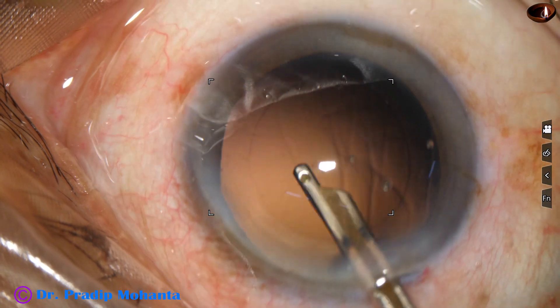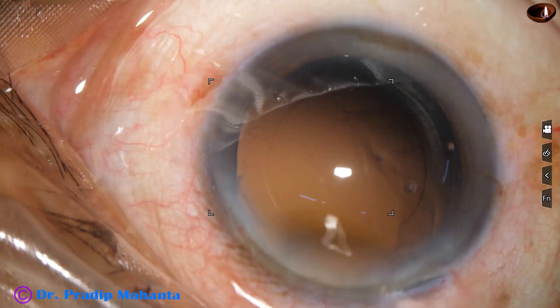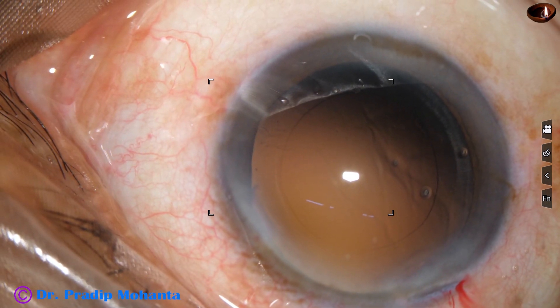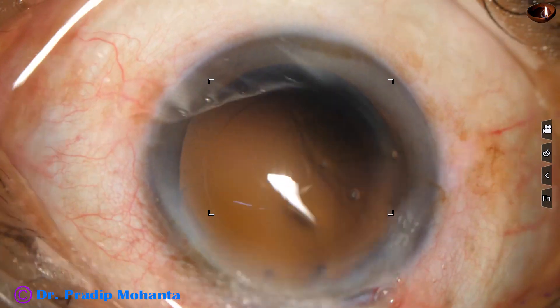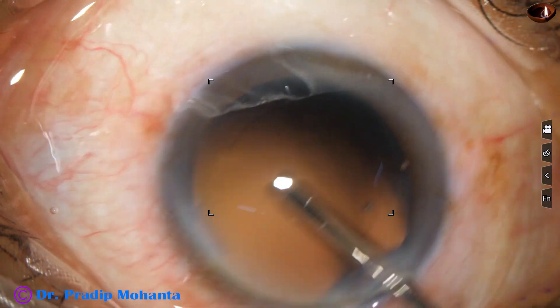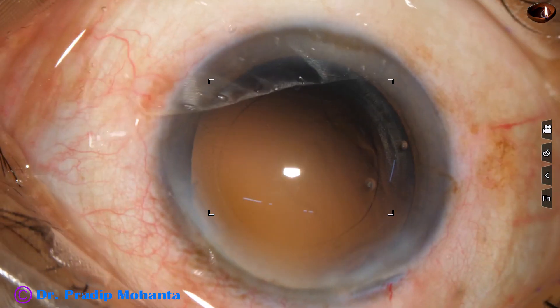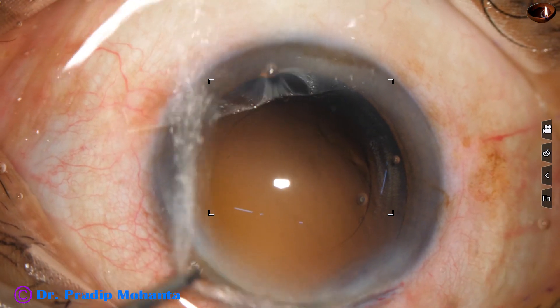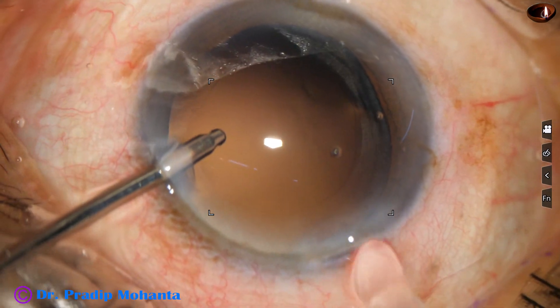And now, what is hydropolish? Hydropolish means use of only the irrigating probe for polishing. The irrigating probe is introduced and tilted 90 degrees, then swept over the posterior capsule. All the cells that stick to the posterior capsule get dislodged and come out.